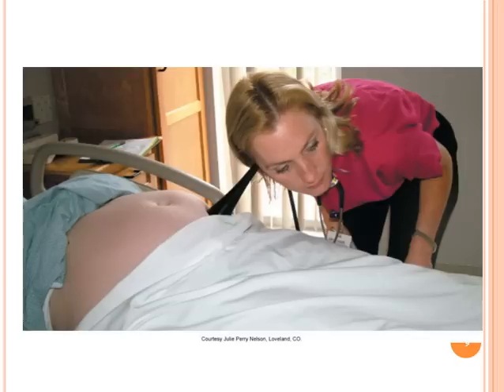This is an illustration of a nurse or a midwife using a Pinard stethoscope. This is figure 15-1 in your textbook.